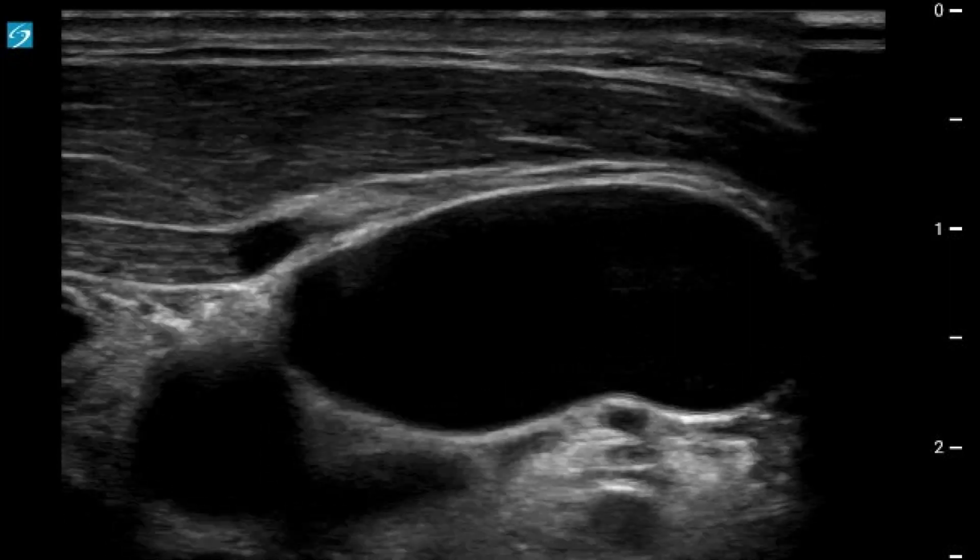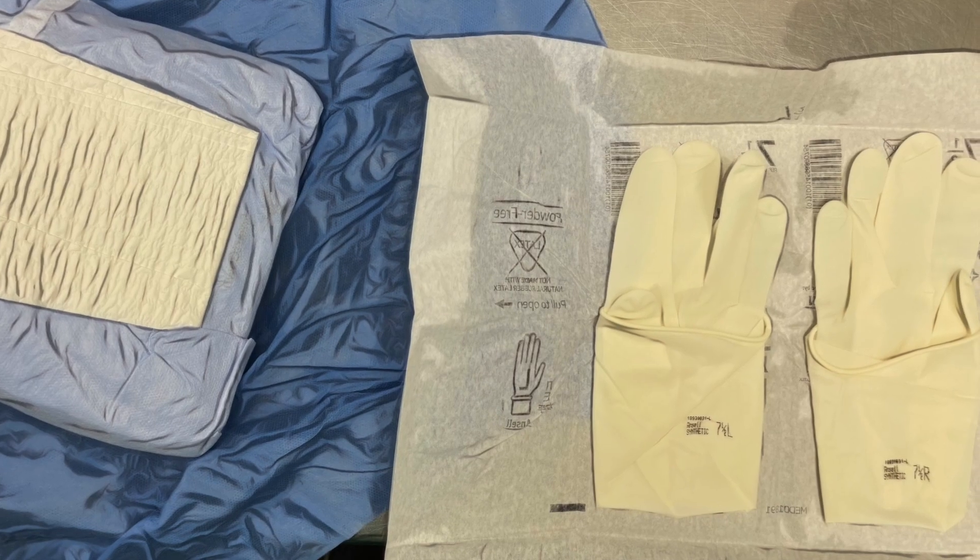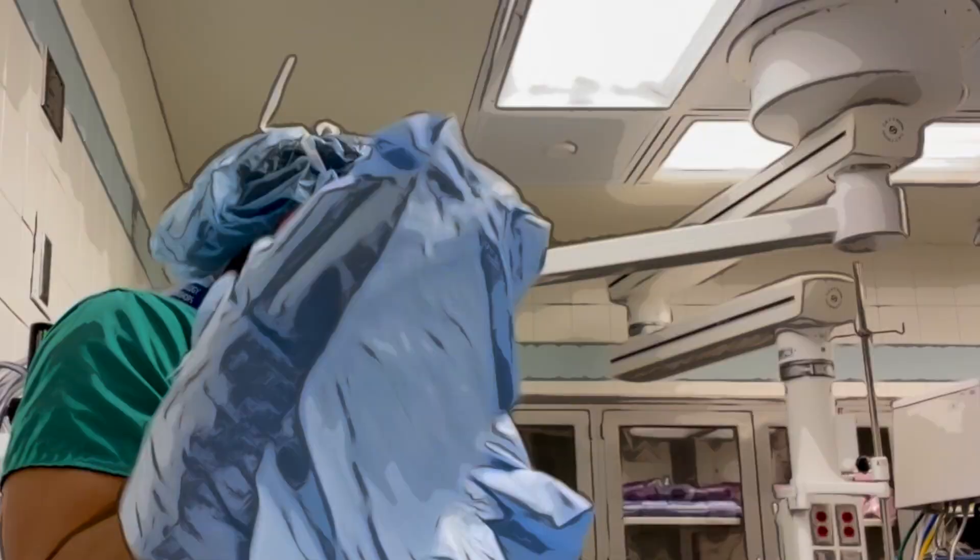If no surprises, I prep the neck and as it dries, I carefully open my gown and gloves. I go scrub, I gown, and I glove.